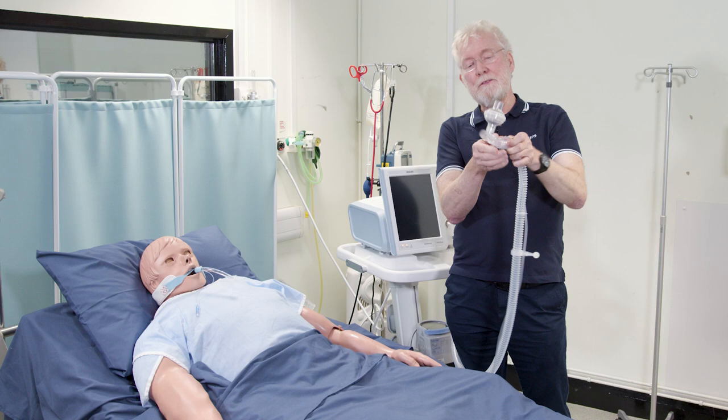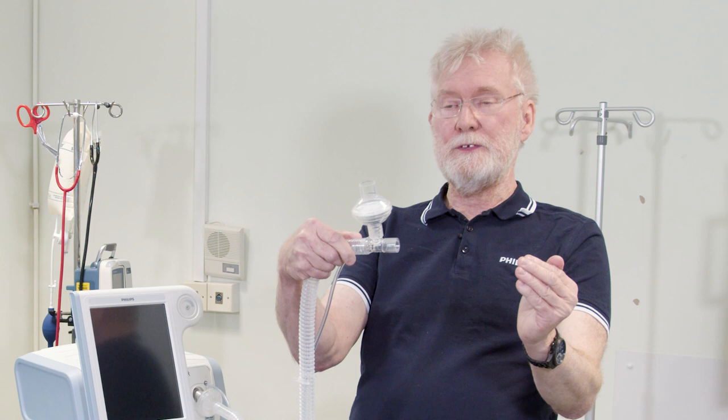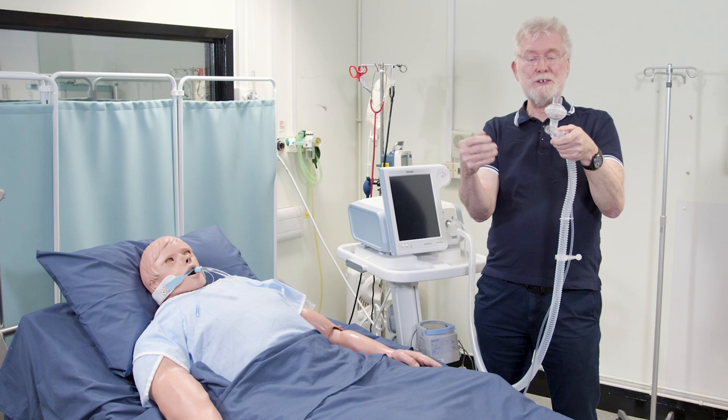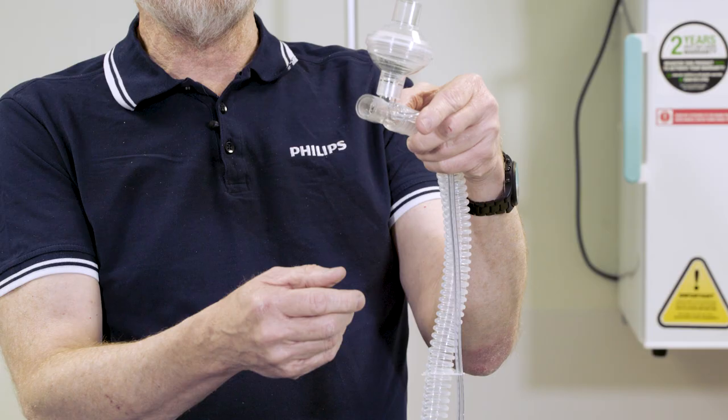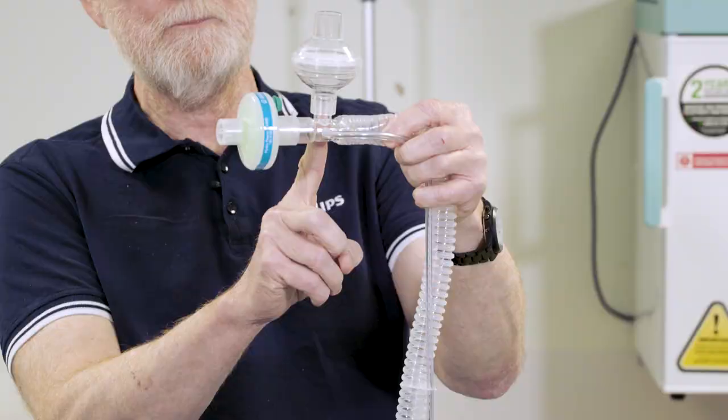This is the setup that you would attach to a mask under normal NIV conditions. However, if you're going to use it invasively, you have to add an HME to this system to provide heat and moisture to the airway. If you're using an HME, it should be placed in front of the passive exhalation port, like this.